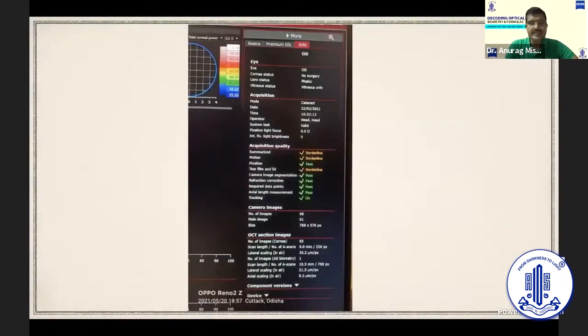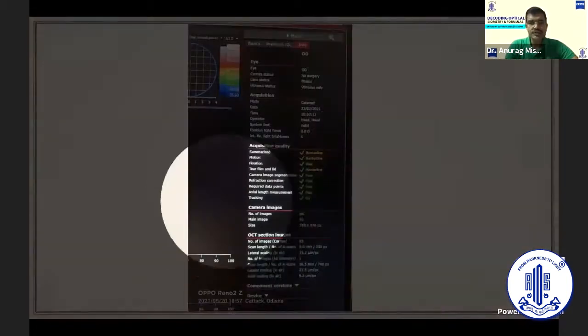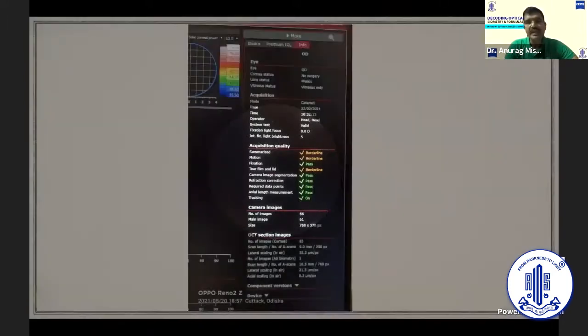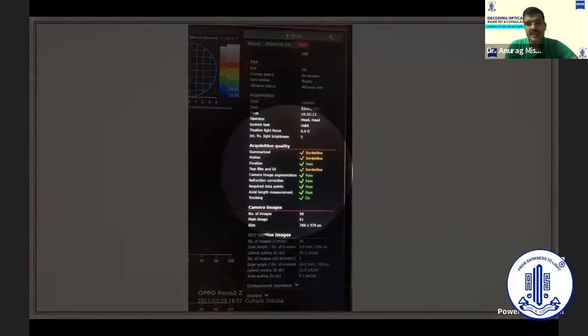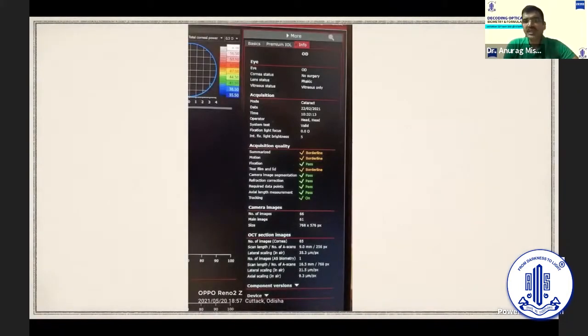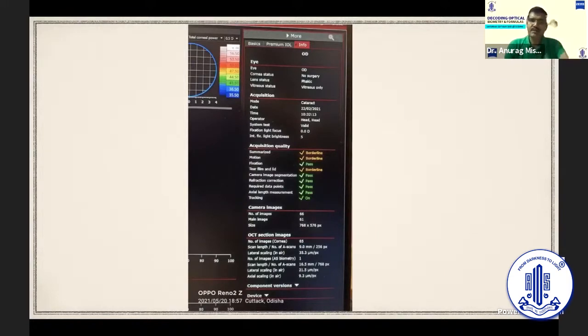This is the reliability indices of the Anterion, which shows here the acquisition quality. As you can see, there are various parameters here, including right in the middle, the tear film and the lid, the tear film validity is also there. So if it is borderline, you can still go ahead and accept it. If it is not borderline and if it's poor, then the machine always cautions you against taking that reading into account and planning your IOL with that.